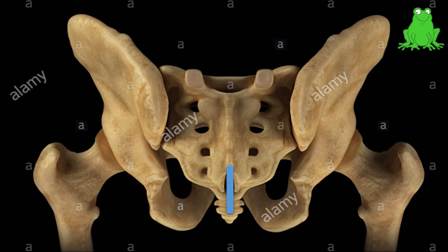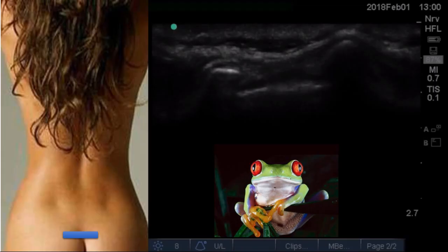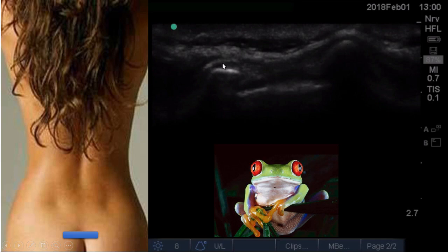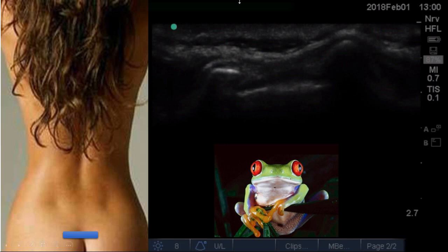When we put the probe on the sacral hiatus horizontally, the ultrasound picture shows two hyperechoic sacral cornua. It looks like frog eyes — two hyperechoic structures bilaterally. In between the two sacral cornua, one structure is muscle, another is the sacrococcygeal ligament, and the hyperechoic structure at depth is the dorsum of the sacral base. The anechoic part is the caudal epidural space.